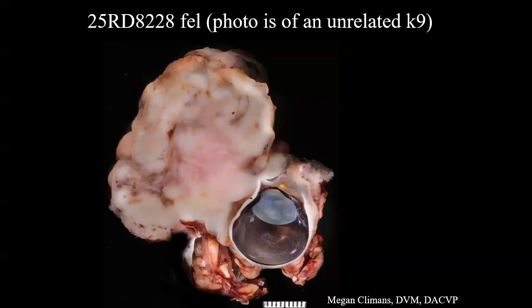Grossly, this mass was kind of like tenuously adhered to the globe itself. So you'll see that it's kind of weirdly separated and such.